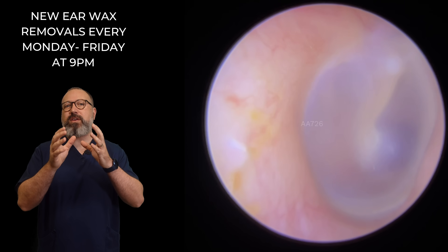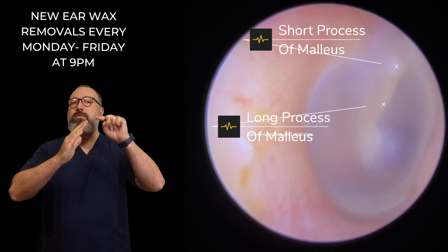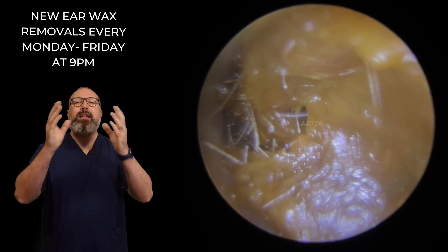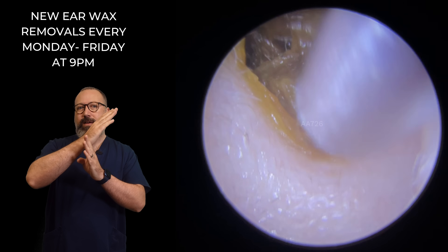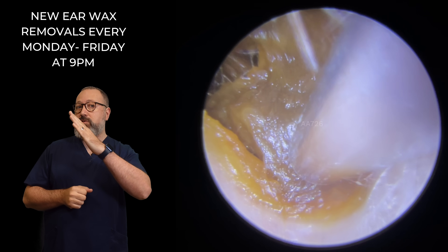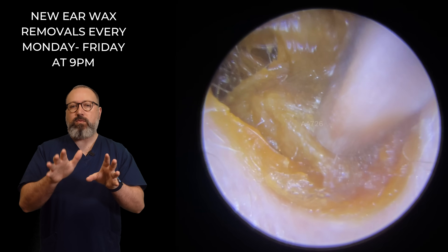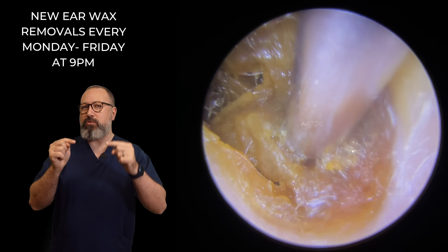There's the eardrum. We're going to look at two things: the long process of the malleus — that diagonal white line — and the pearl at the top, which is the short process. If the long process and short process are like the hands of a clock, with 12 o'clock at the top, pointing to 10 or 11 o'clock means it's a left eardrum. Pointing towards 1 or 2 o'clock means it's a right eardrum.